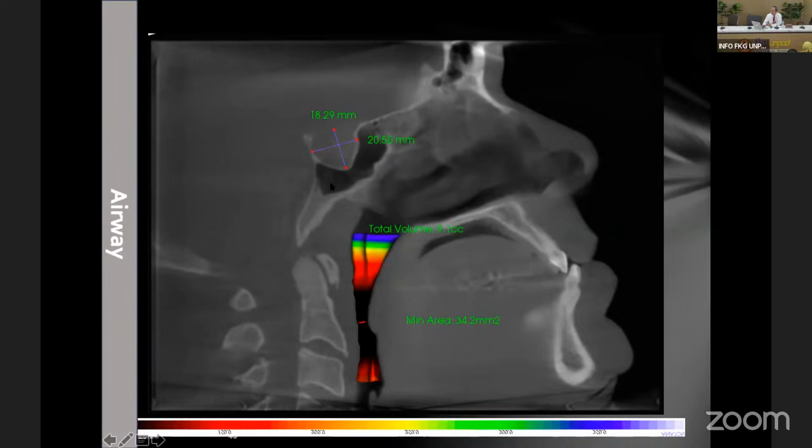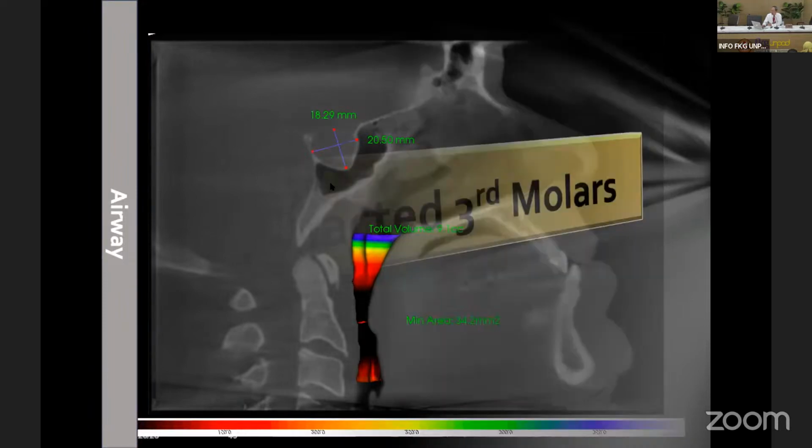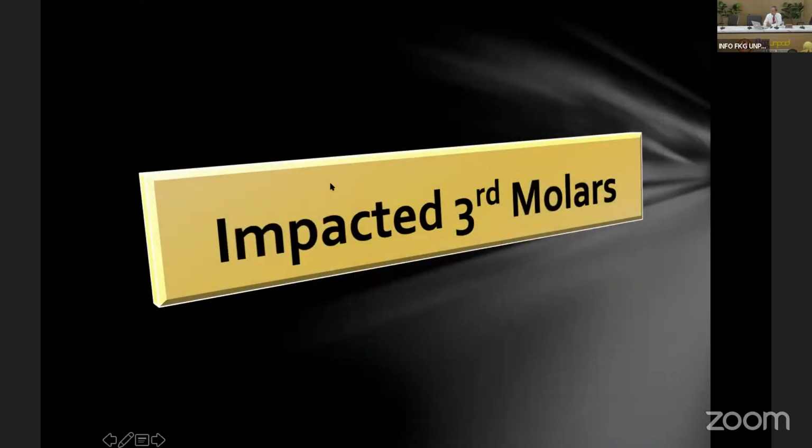So this is a patient with a pituitary tumor inside the sella turcica. Those kinds of patients, sometimes if hormone is produced, can develop gigantism, or there may be some narrowing of the airway.